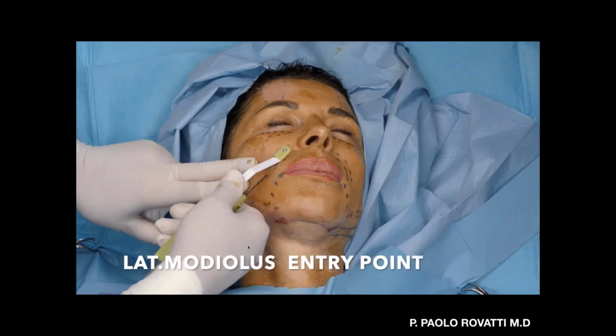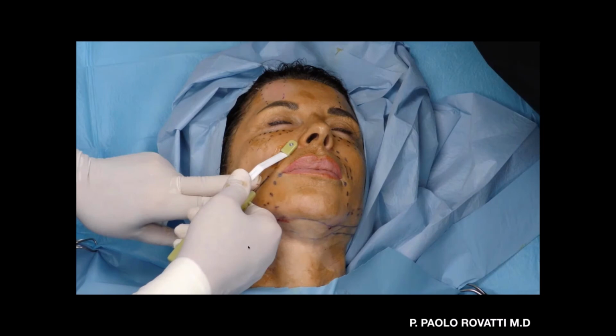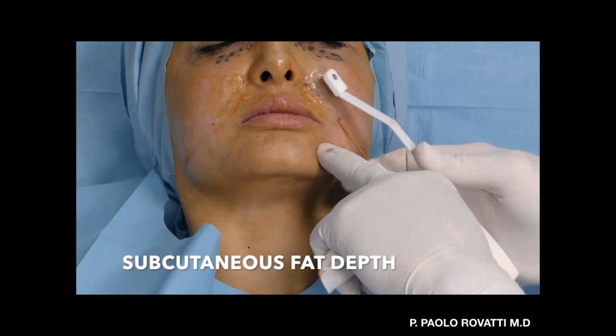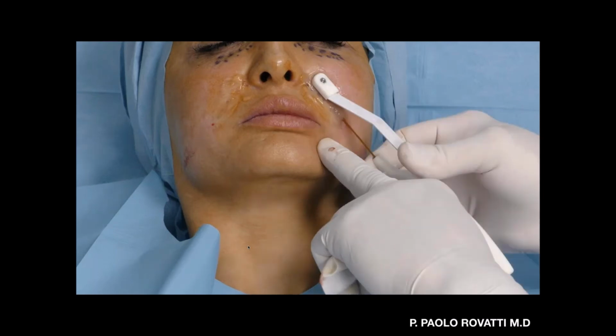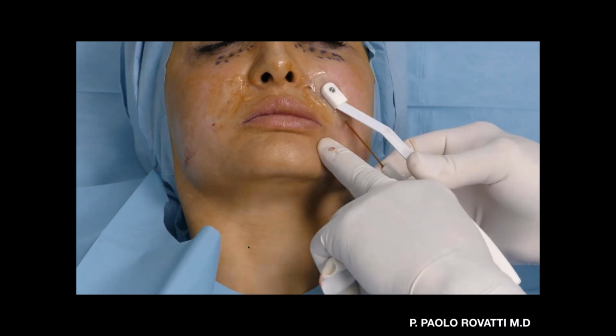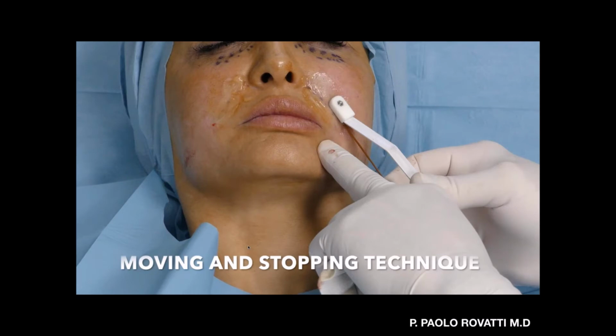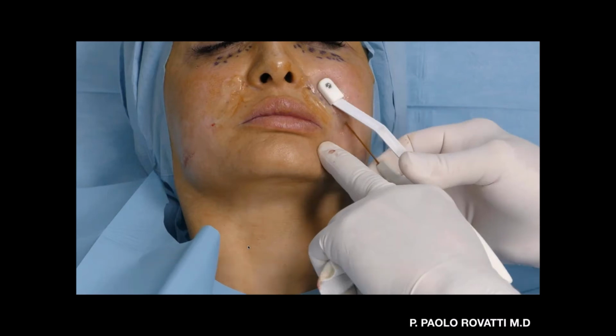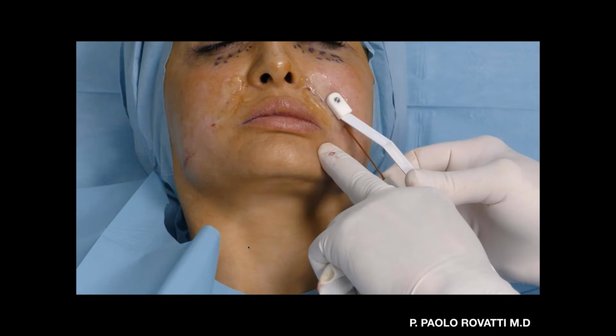So maybe now you see stopping because it's not fluid, but you can see that now it's a stopping technique because I'm reducing the fat. You must know that if I'm stopping, I'm hitting more the vertical septa, so I'm reducing the depth of my tissue. If I'm moving backward, the heating goes preferentially to the horizontal septa, so we have a contraction, a tightening of the width of the tissue. So we can have a 3D contraction, of both depth and width of the tissue. So look, this is stopping.